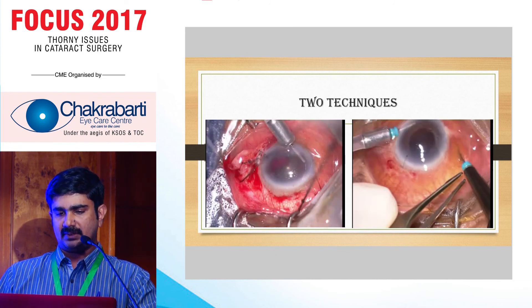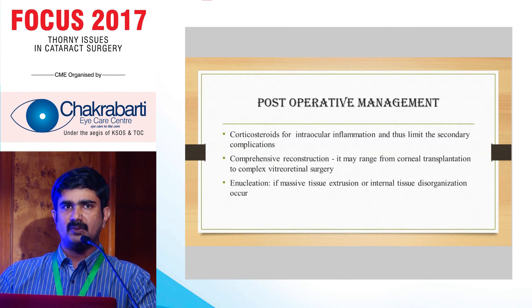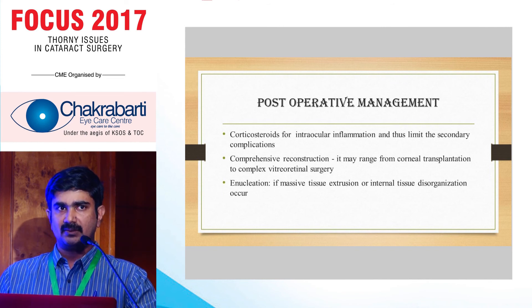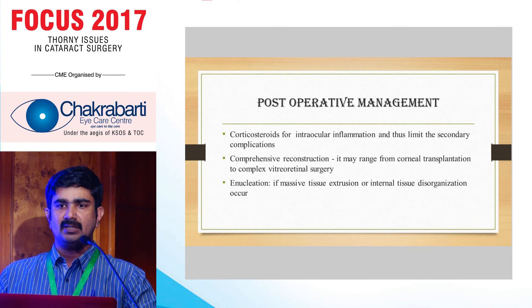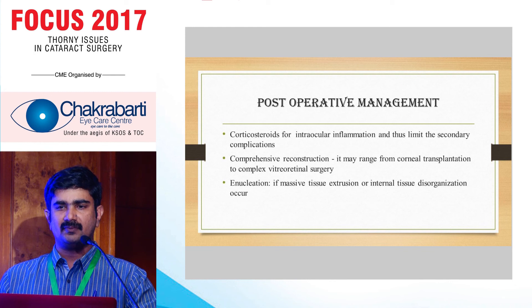Two techniques are commonly used. In both, it is very important to have an infusion cannula into the AC — either a standard vitrectomy infusion cannula or an AC maintainer — to push fluid into the eye and push the suprachoroidal hemorrhage out. In the first technique shown, a trapdoor incision is made at the highest point as determined by B-scan. You can see initially serous fluid coming out, then dark blood draining profusely.